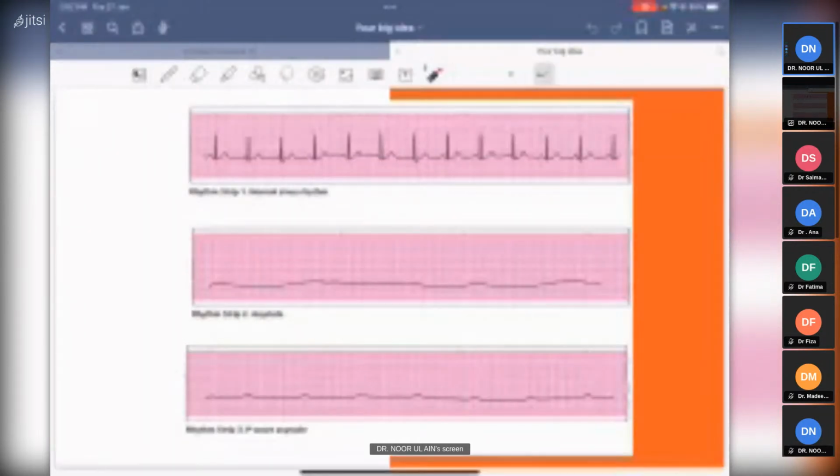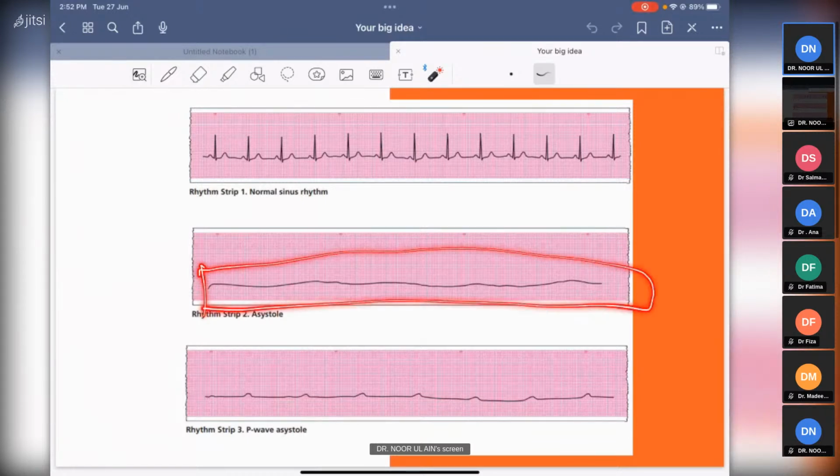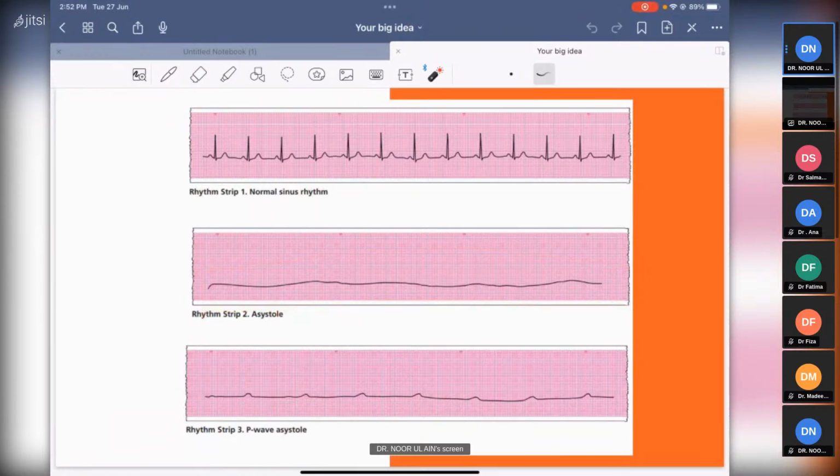And never expect asystole to be this way. Never expect a straight isoelectric line. Why? Because imagine a person with an acute coronary syndrome, ACS. Maybe he had VF, and after that your monitor started showing this. Okay? So do you think, while you're still doing CPR, doing chest compressions, and there's some sort of manual blood circulation happening, the asystole line would be a straight isoelectric line?